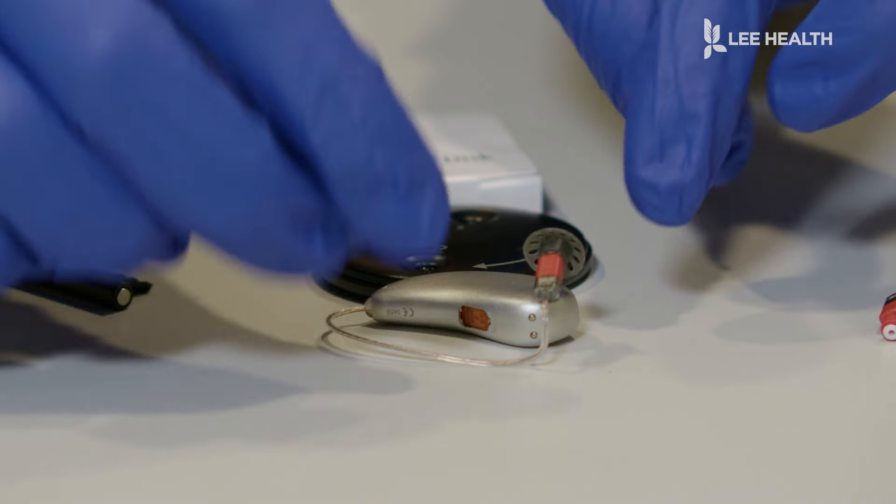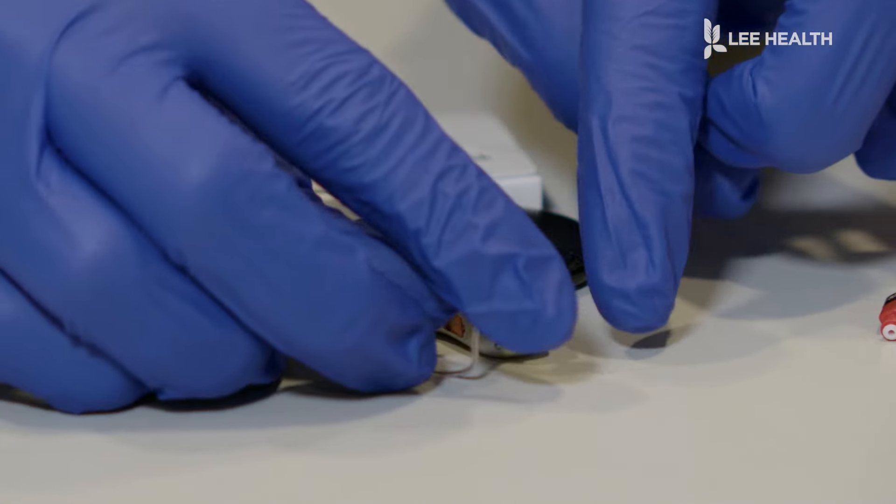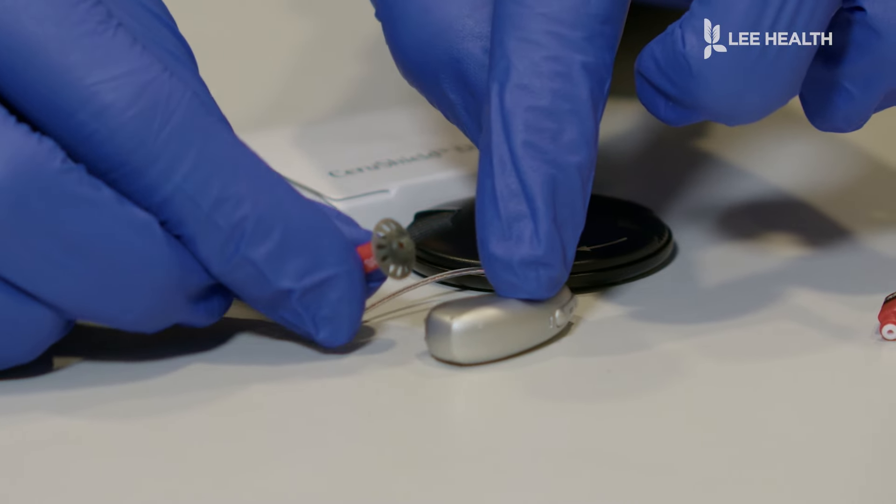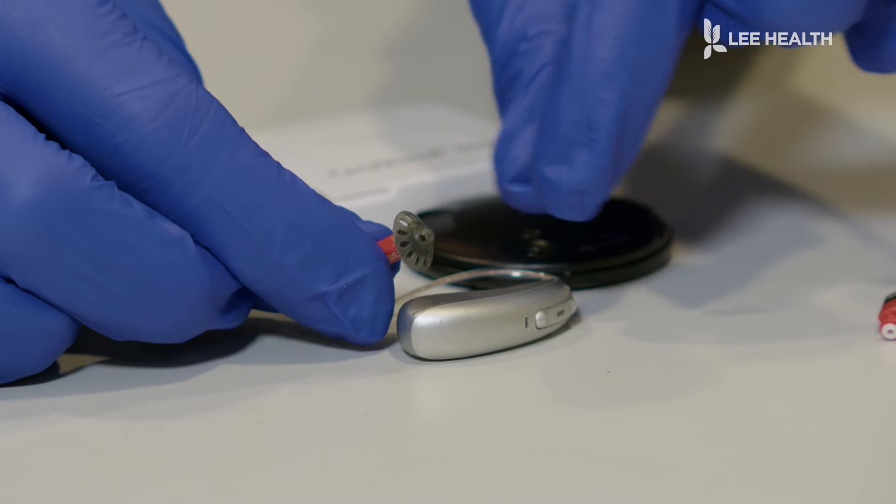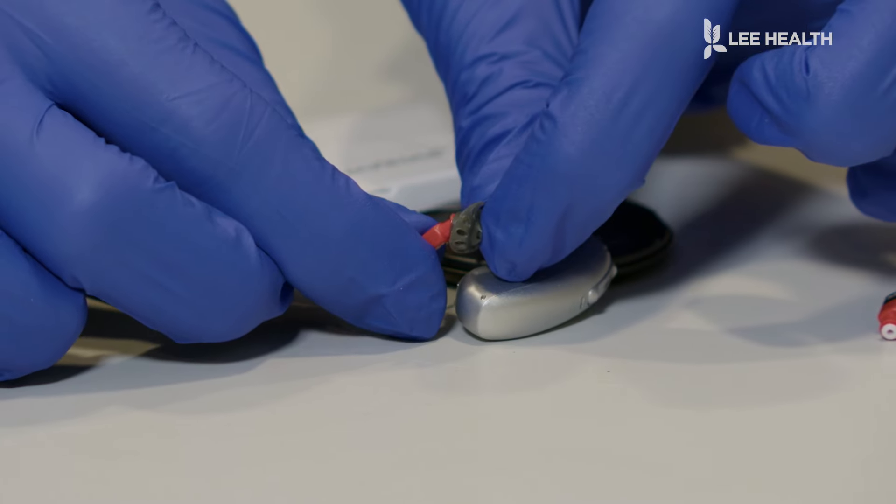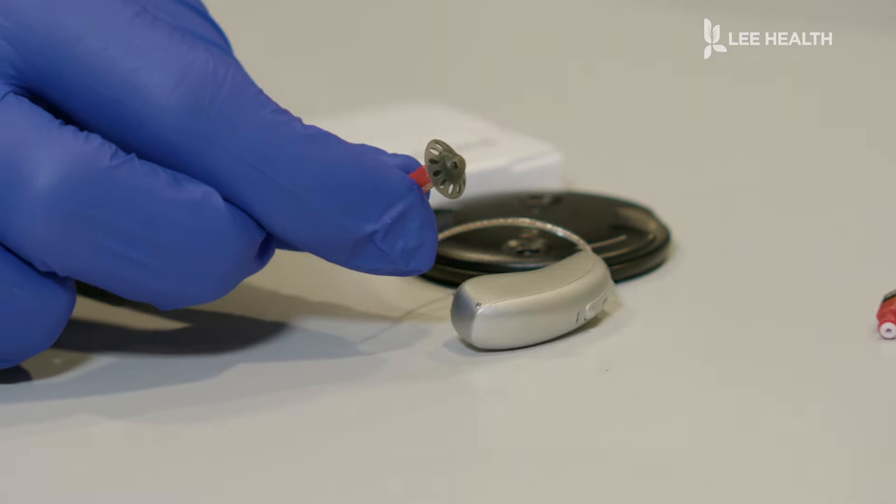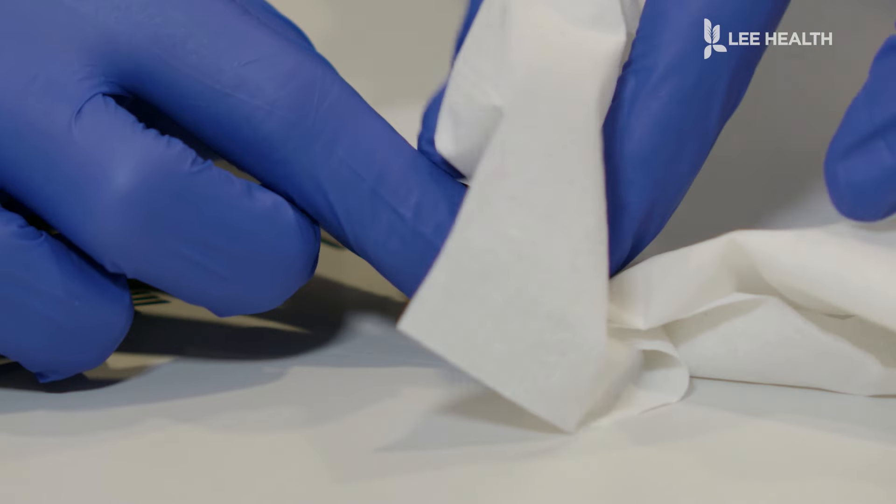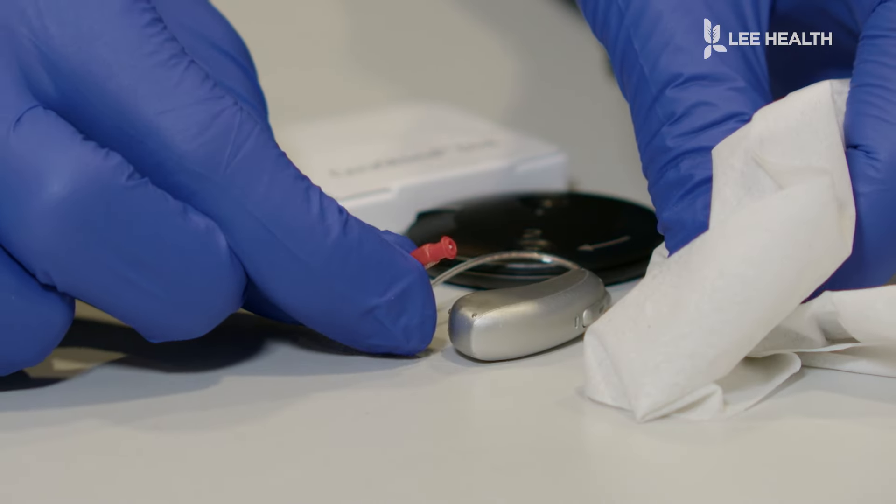Next, we're going to be removing this rubber dome here. So if you can just grip the piece, the end receiver of this hearing aid, and then peel it off and disconnect it like that. If it's hard to grip, you can also grab a tissue, and a tissue can help sometimes grab and remove that piece.